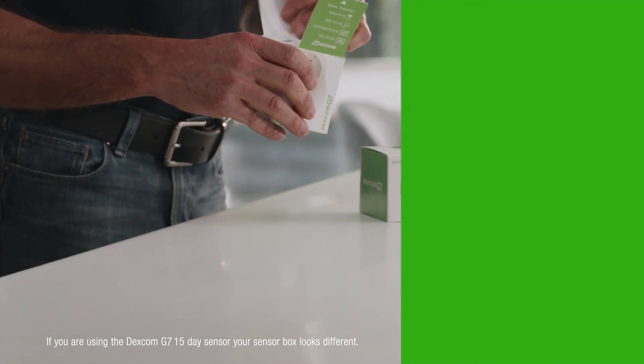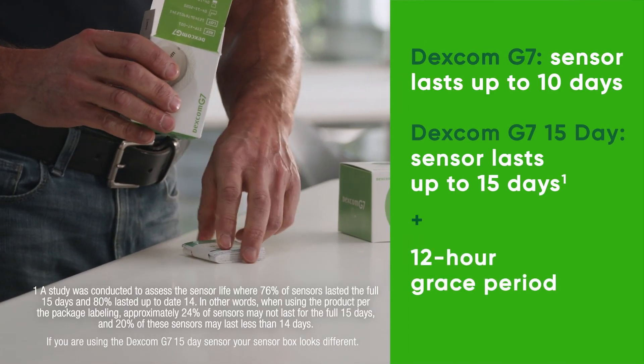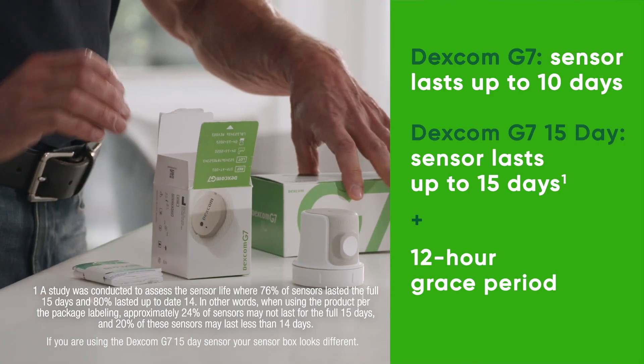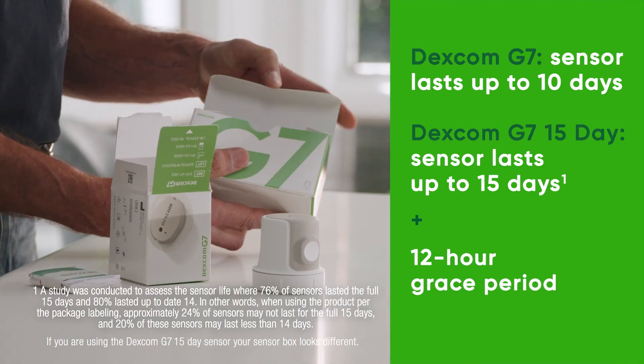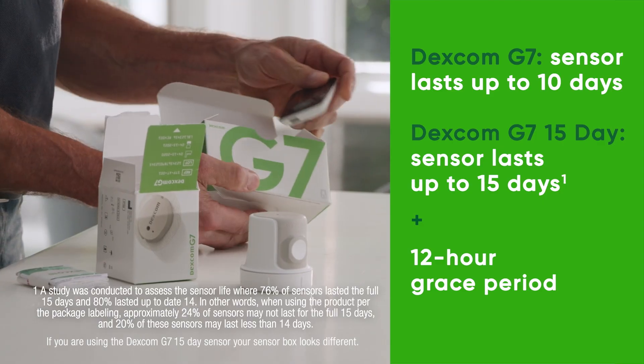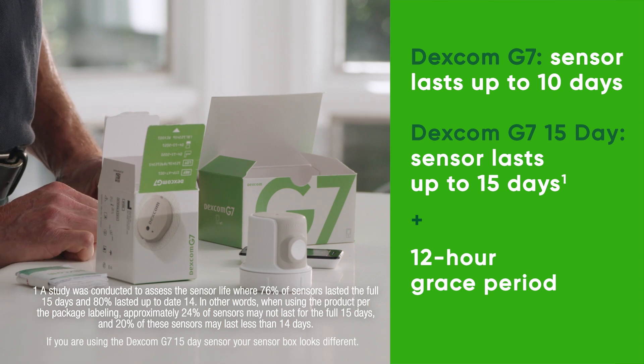Both the Dexcom G7 and Dexcom G7 15-day sensor work with the Dexcom G7 receiver. Your sensor box contains your sensor, overpatch, and instructions for use. Your Dexcom G7 receiver box contains your receiver, USB cable, and power adapter.